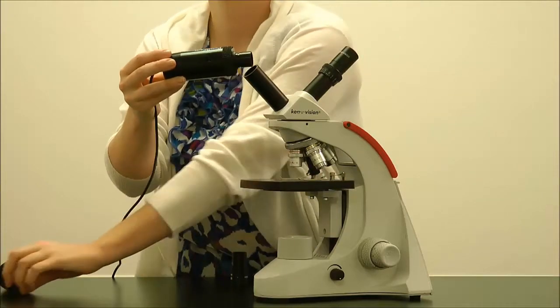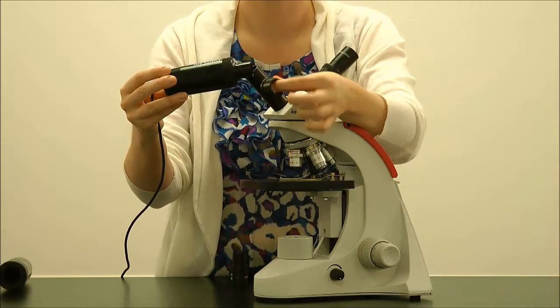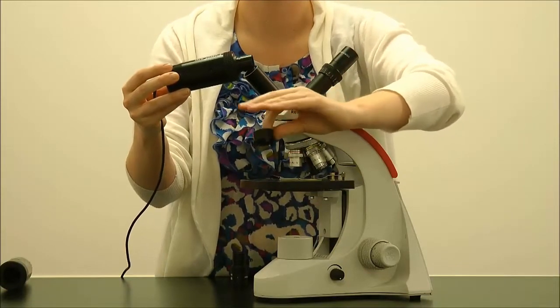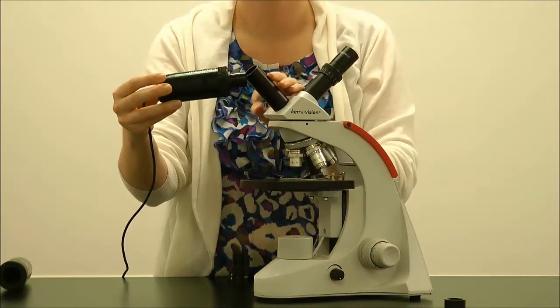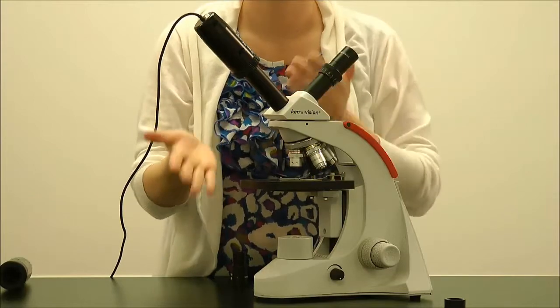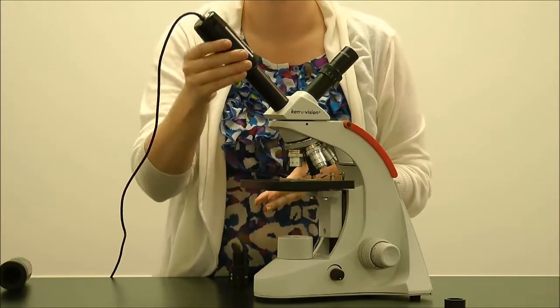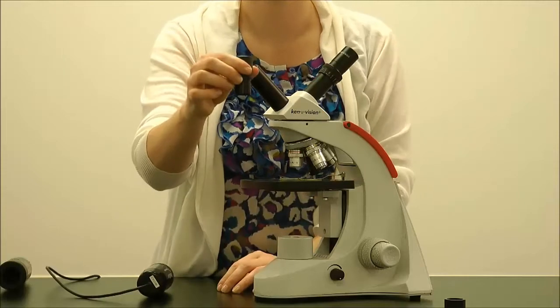You will not need the eyepiece adapter for this. Now your microscope has become digital and you can use Applied Vision 4 software. When finished, replace with the microscope eyepiece.